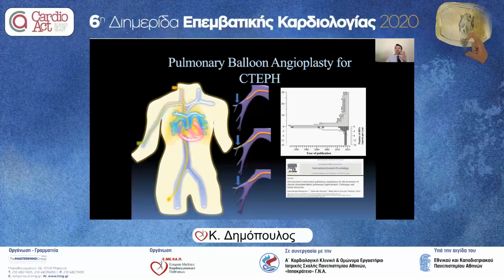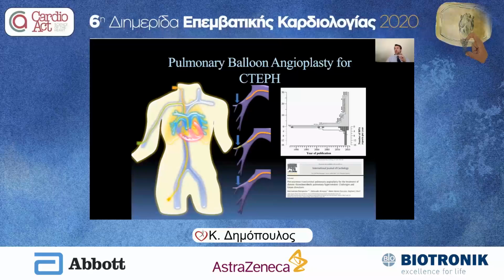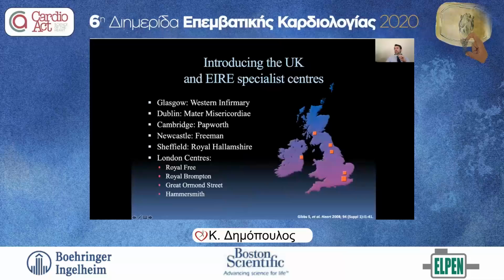let's not forget when we're in there and we have a patient, for example, with chronic thromboembolic pulmonary hypertension, during your right heart catheter, you probably want to be doing invasive pulmonary angiography, especially if your CTPA or MRPA have been suboptimal. And of course, there is now this new technique where you can actually dilate stenosis in patients with CTEPH, mainly those who are inoperable, and you can do that percutaneously.